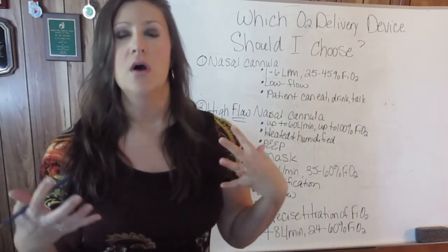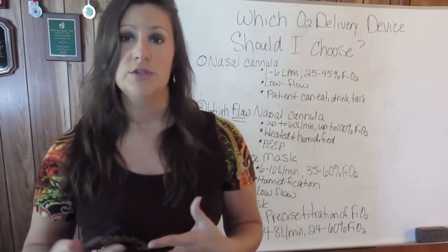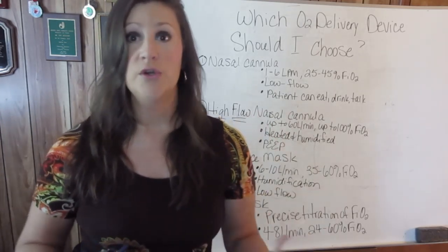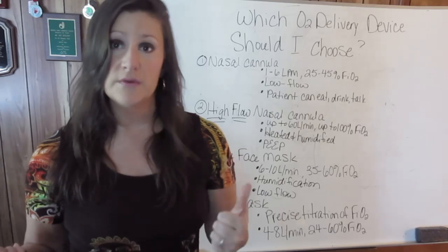In this video, I want to talk about some of the different oxygen delivery devices that you are going to learn about in nursing school, and talk about maybe when is the best situation to use these particular different devices, and the difference between FiO2 and liters per minute. So let's just dive right in and start talking about these oxygen delivery devices.